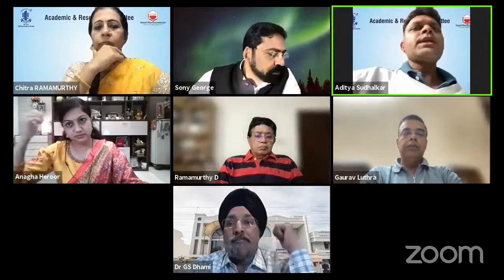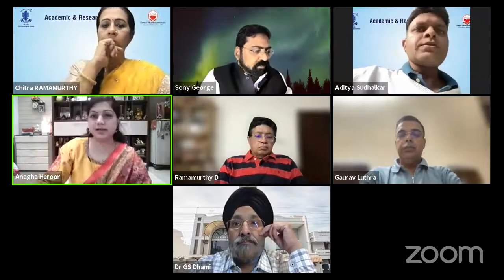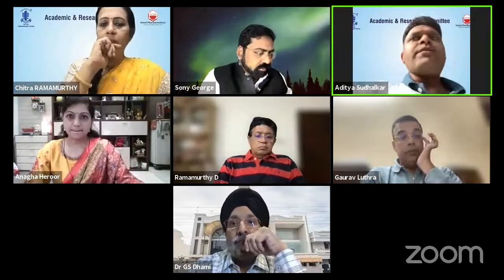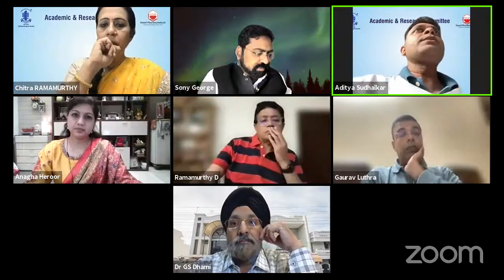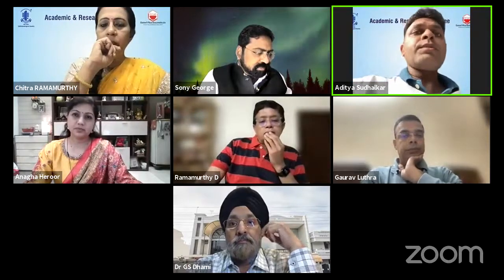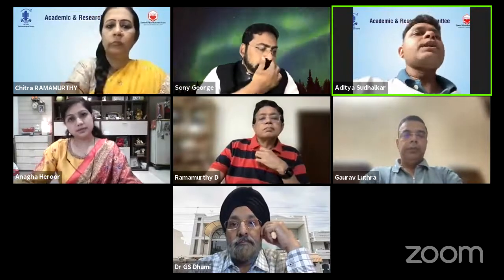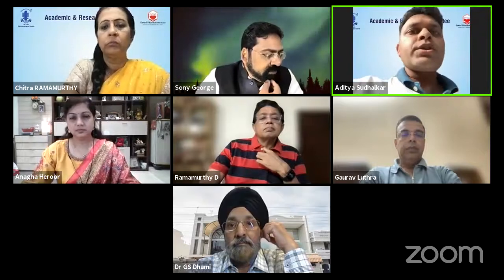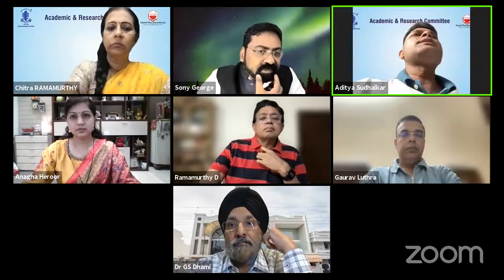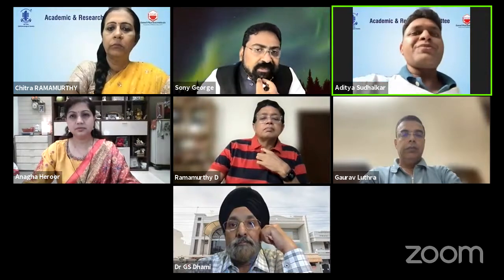Yes, absolutely. That is a definite alternative. Yeah, so this is a definite alternative. And in fact, it can even be done after the cataract surgery, because then you're assured that your phacoemulsification and IOL implantation has gone off uneventfully, and there is no rent or anything that would, again, predispose the eye to anterior migration of the implant. So this is something that varies from surgeon to surgeon.